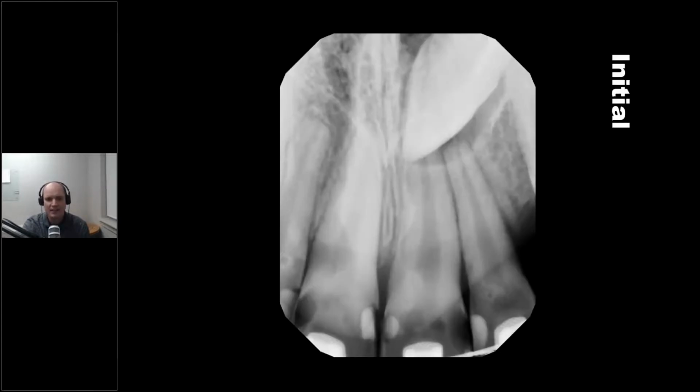This is one that I saw. I didn't do these restorations initially, but this is a child or adolescent that came in with braces, a very high caries risk. Here you can see someone else did composites, which we talked about, and I made the same mistake. These composites came in and there's recurrent decay. Some of them had fallen out, and I learned my lesson from placing composites in the high caries risk kids.